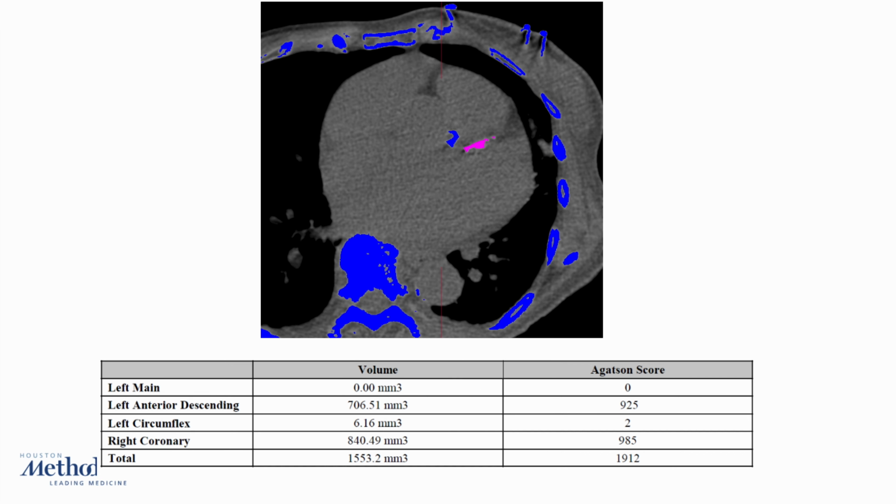Clearly, there is an ischemic perfusion defect. It's a smaller one, limited to the distal LAD and apex. She still went to the cath lab. The calcium score I didn't show you, it's 1900.